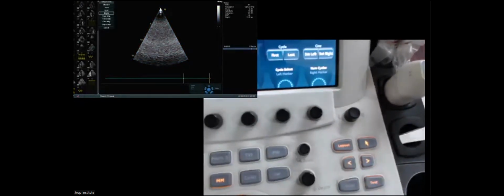Sir, what is the change of the color for the obese patient called? Could you please repeat? This is a change of a color for obese patients. You go to the screen, we have color maps. If you look at the color maps over here, I can change this color map to multiple different colors. We can call them B-scan colors. Sorry, sir. B for Bombay, B-scan colors. B-scan, sir. Thank you, sir.